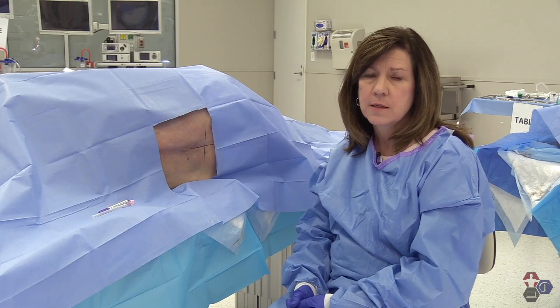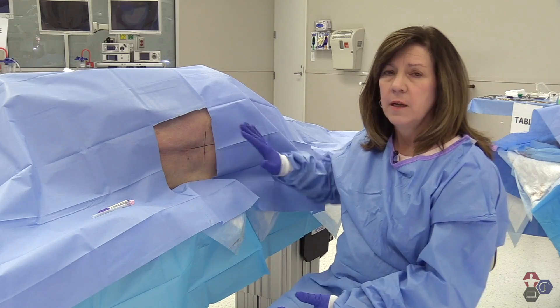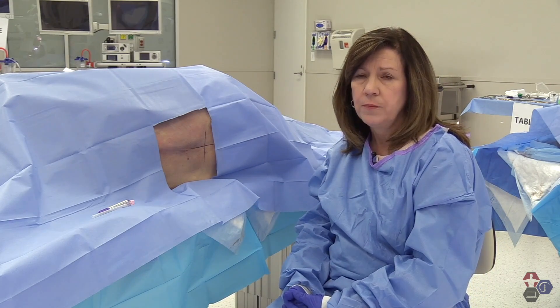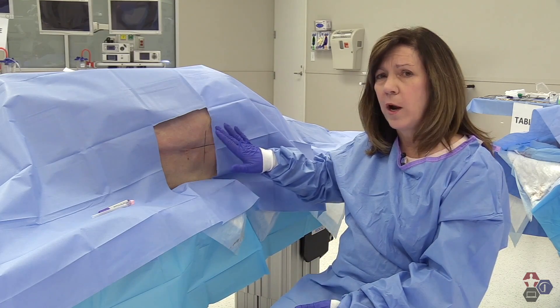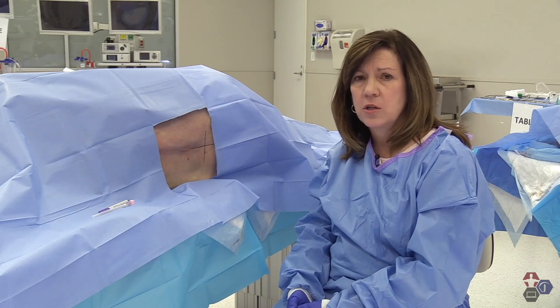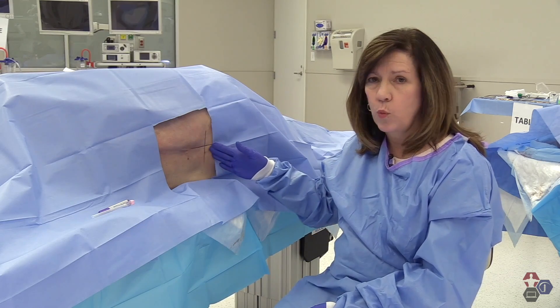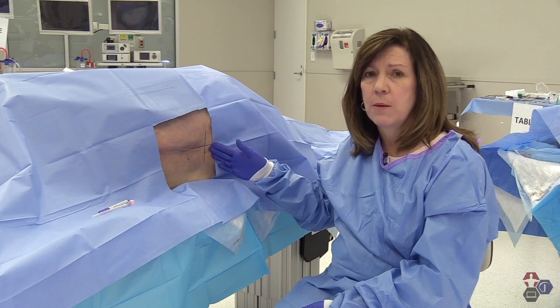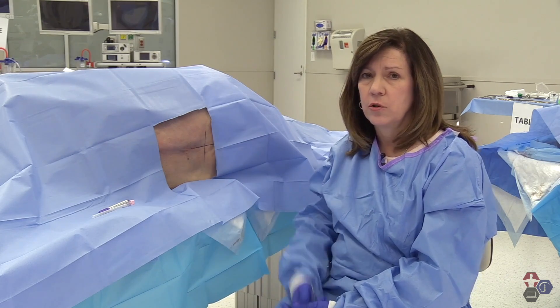Regarding infection — this is a sterile procedure. We want to make sure that the field, the skin, and all surfaces in contact with the procedure are sterile, so that we don't introduce bacteria into the spinal fluid when no bacteria previously existed. The last complication is nerve damage. We prevent nerve damage by going well below the level where the spinal cord terminates, and by doing a neurologic exam of the lower extremities and the lumbar sacral spine before and after the procedure.